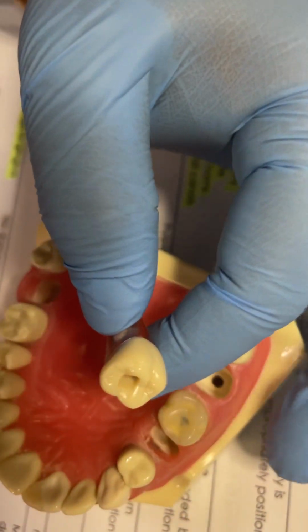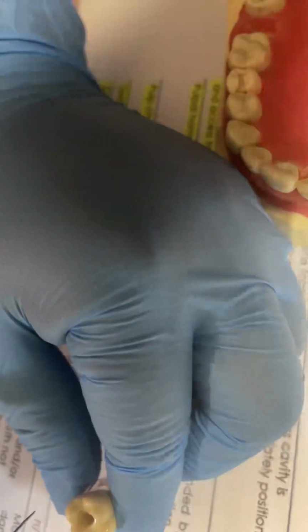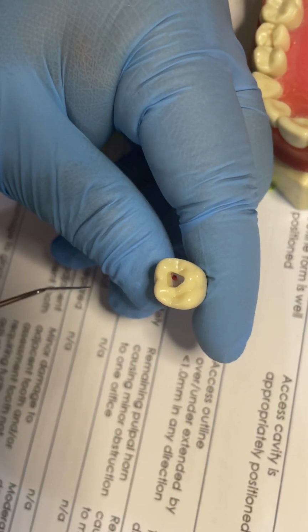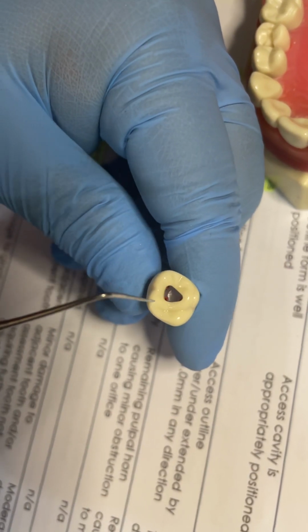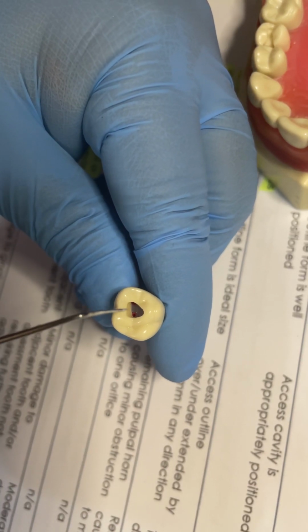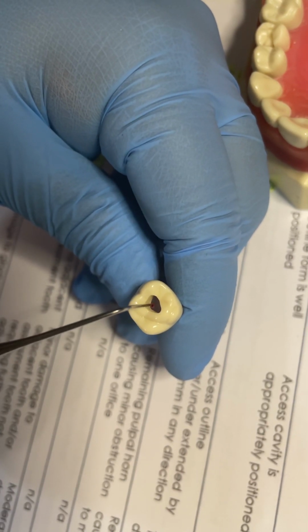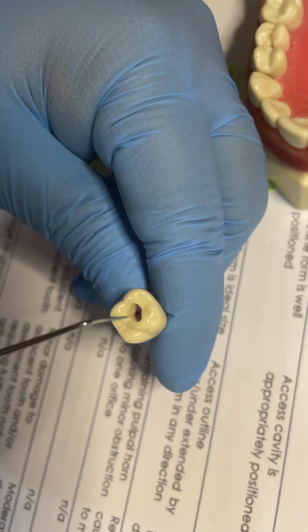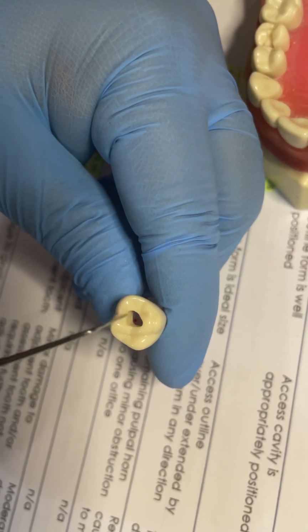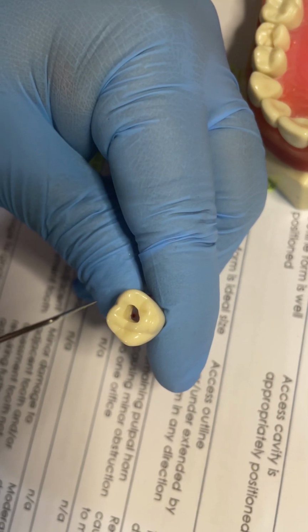When we do the preparation, the 2-6 and 1-6, we have to come a little to this side. The 2-6 preparation comes like this, a triangle with two long sides and one short side. Two equal long sides, and the base will be shorter, buccally.